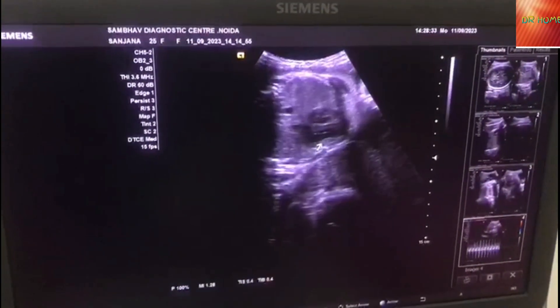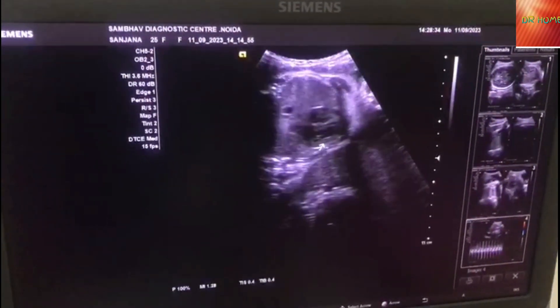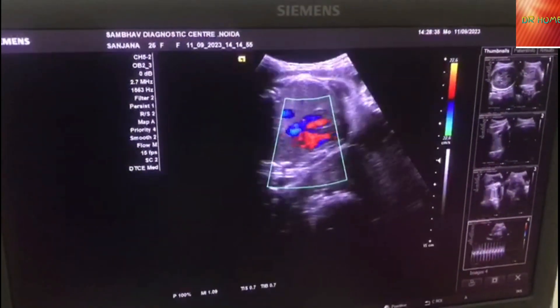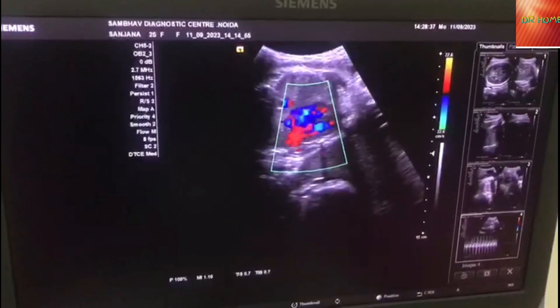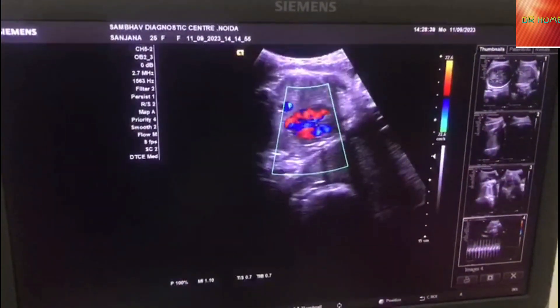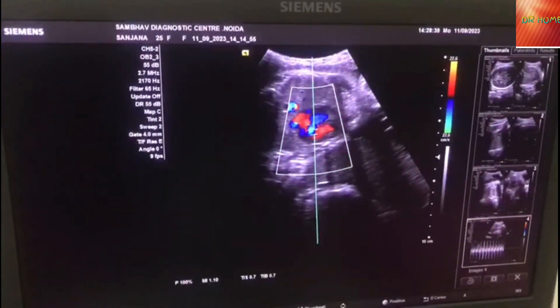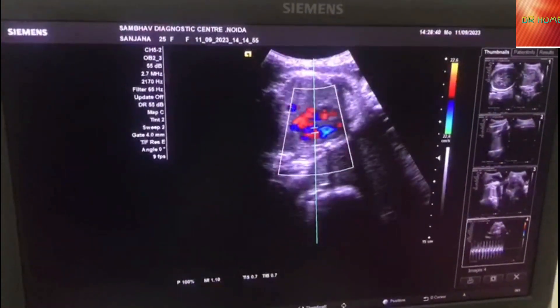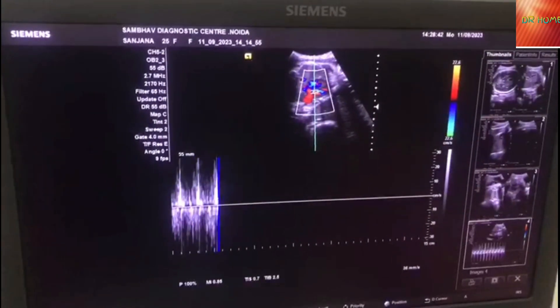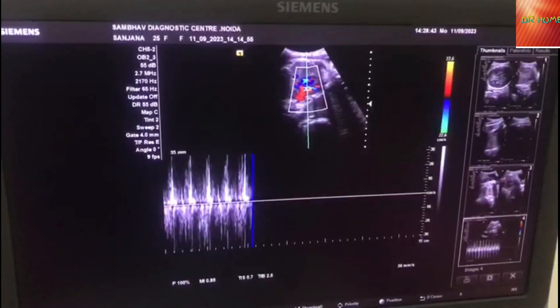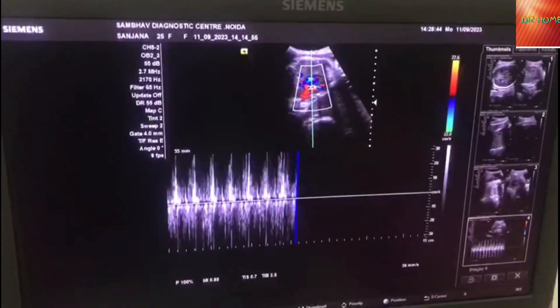This is the child's heart. We check the child's blood flow to see if it is correct or not using color Doppler.